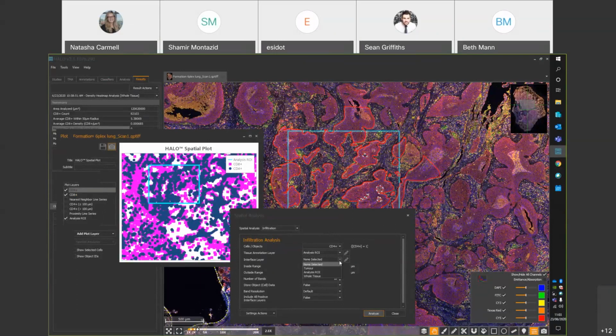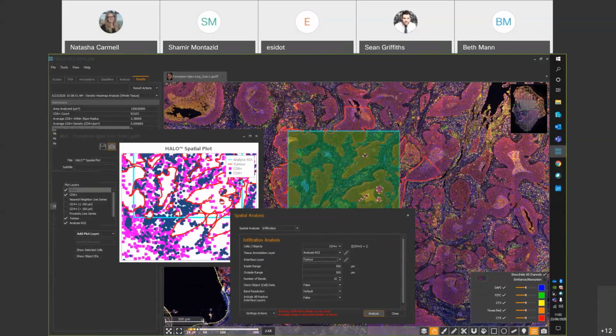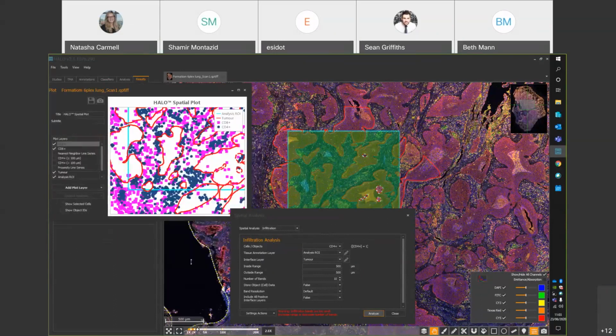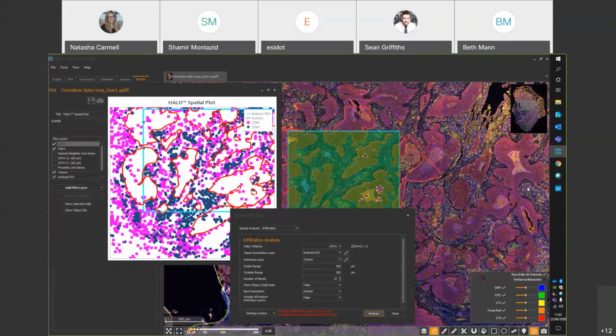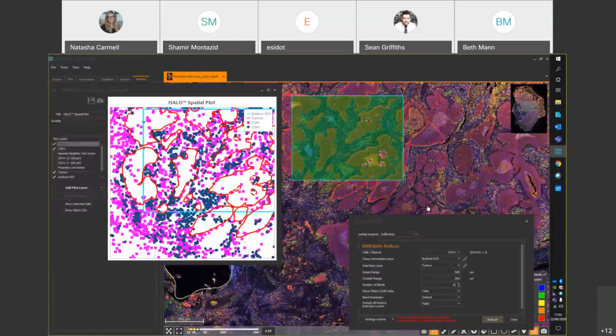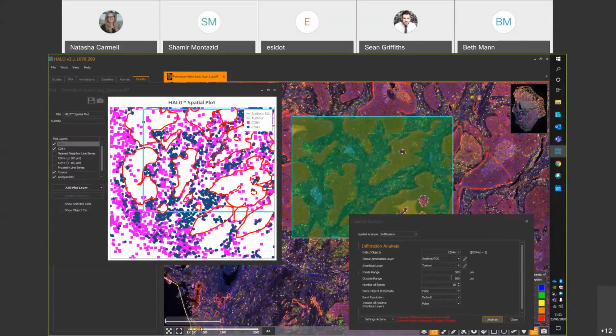And we can then add in our interface layer, which is going to be our tumor annotations. So again, we've now brought those guys onto the plot as well. So lots of colors going on within our plot over here. And what you can also hopefully see is you've kind of got a greeny and yellow markup, which has been overlaid within our region of interest here.